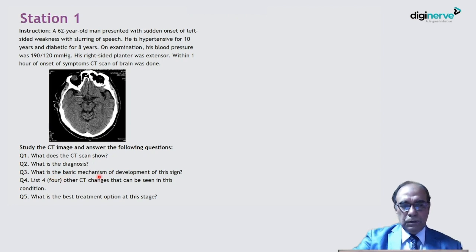Question 3: What is the basic mechanism of development of this sign? Question 4: List 4 other CT changes that can be seen in this condition. Question 5: What is the best treatment option at this stage?